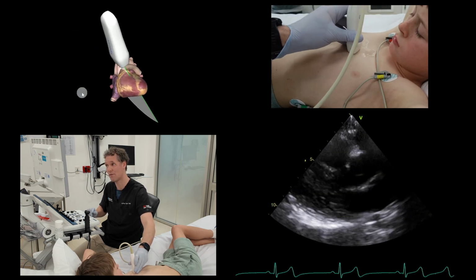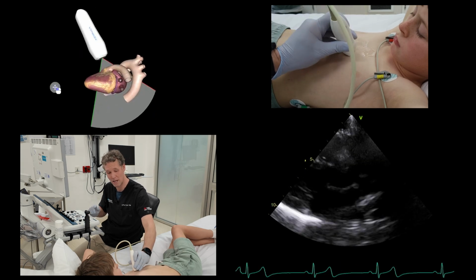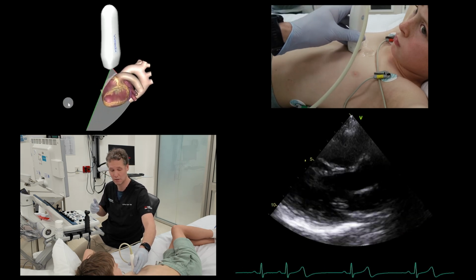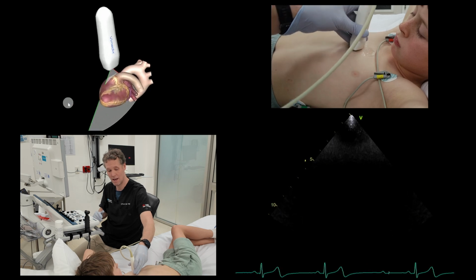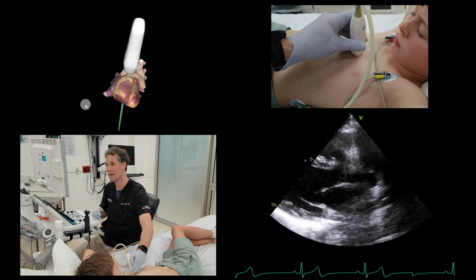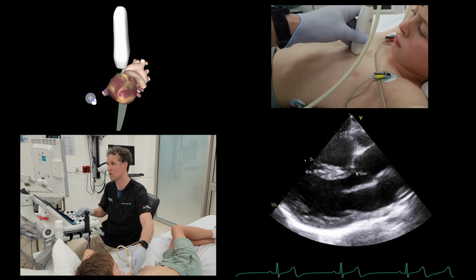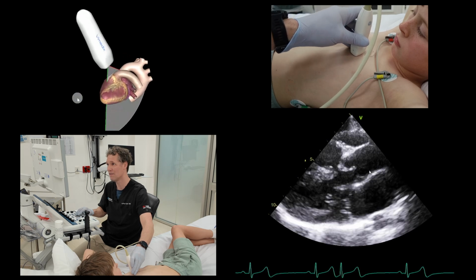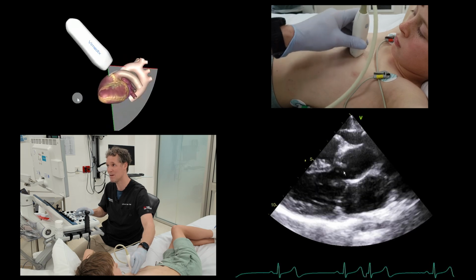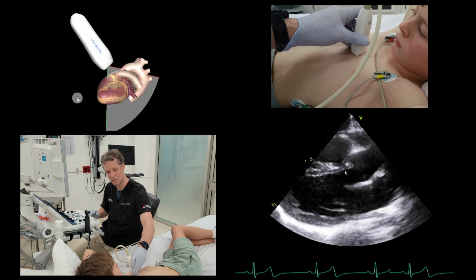And that's different from the next movement, which is known as rocking or heel to toe or fishtailing. This one is where the image stays the same. Like if you have a look here at the aortic valve, for example, if the aortic valve is on the right side of the image, if I do that heel to toe or the fishtailing, I can move it over onto the left side of the image. The image plane stays the same, but the orientation changes.